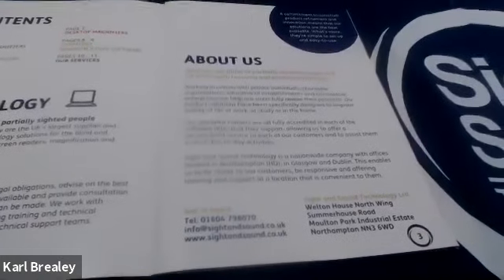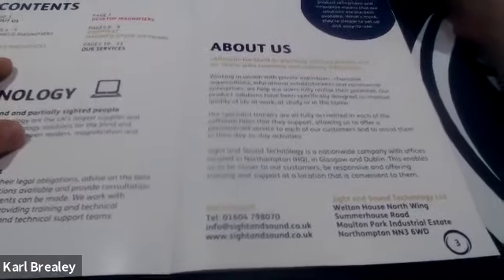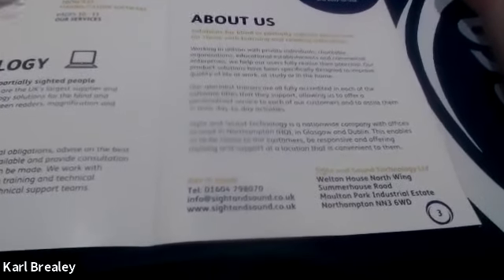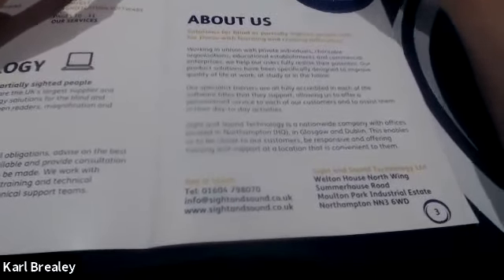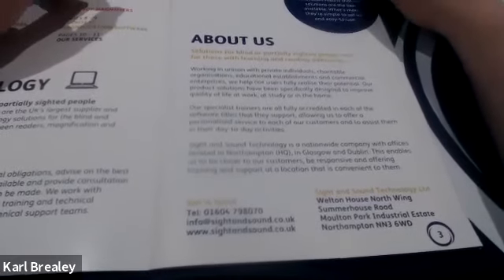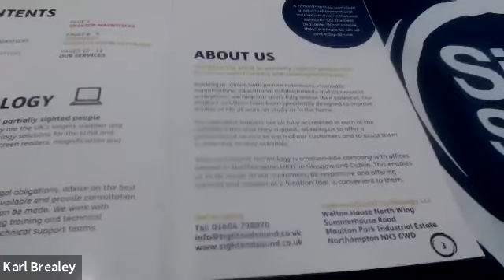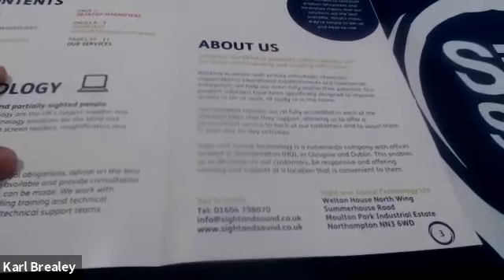Wow. Okay. So, to ask another kind of stupid question, how does it read a barcode, the information, if you were in a shop? That's all pre-installed information. As it is with everything with a barcode, and if you remember, barcodes don't have any best before information on them. Barcodes are created pre-release to the shops. So every product, say a tin of Heinz baked beans, has exactly the same barcode, and the best before date is only printed right before the shipment is done. So the information is all there. That's updated, preloaded, and will come through with updates. If OrCam get an update to barcode lists and whatever, when you connect this to the Wi-Fi, it will tell you if there's an update available. It won't necessarily tell you what for, but it will go forward and update accordingly.